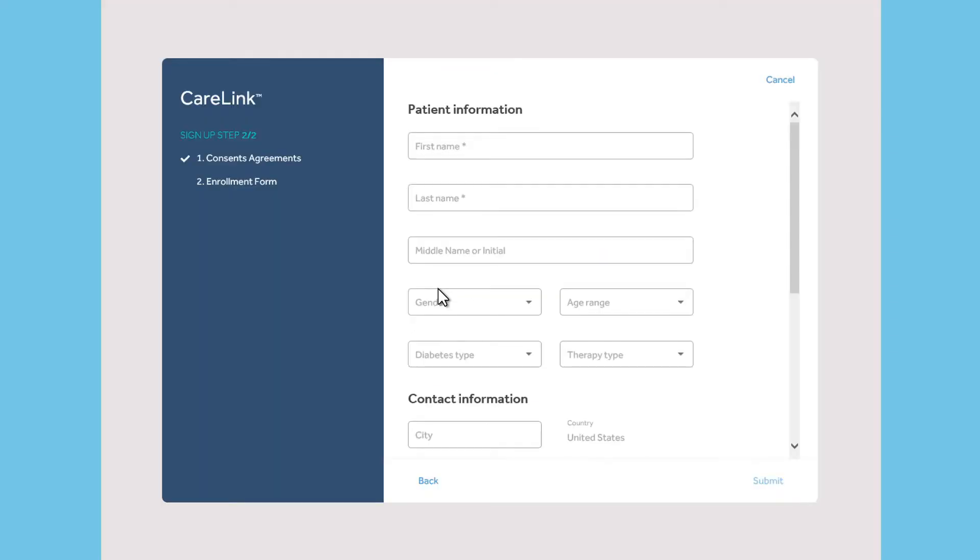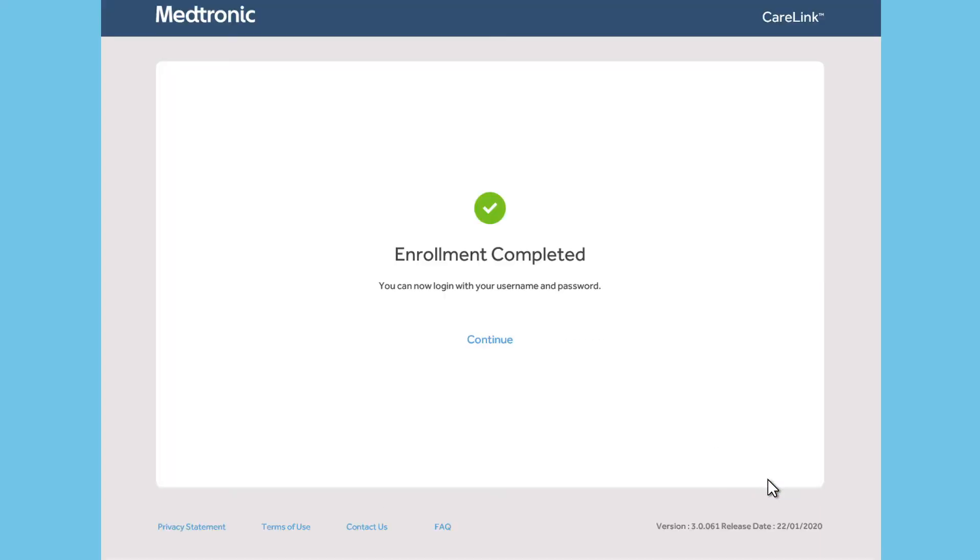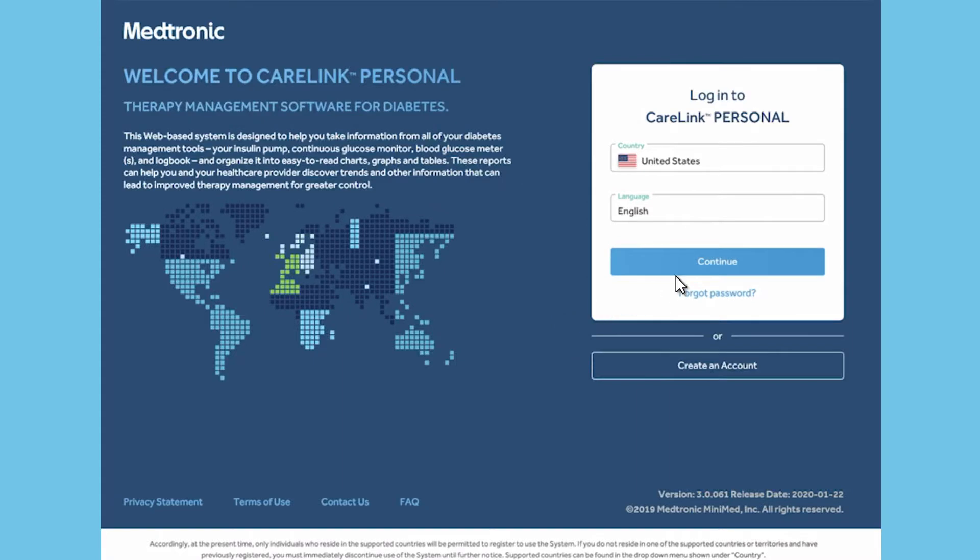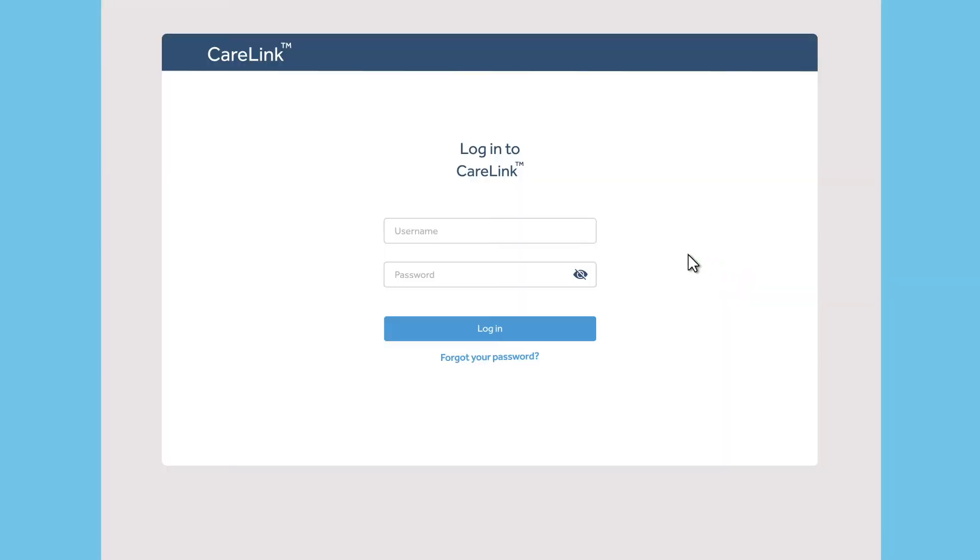Scroll down to complete the other questions. Only the sections with an asterisk are required. When you have finished, you will see the Enrollment Completed screen. Click Continue to return to the login page and enter your username and password to access your account.